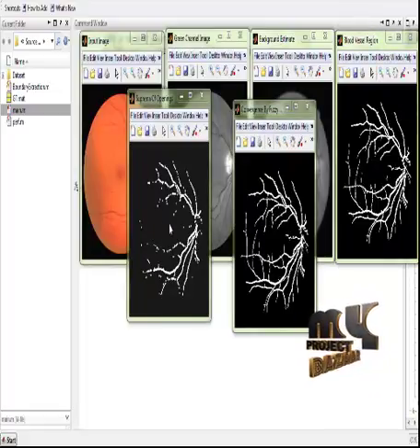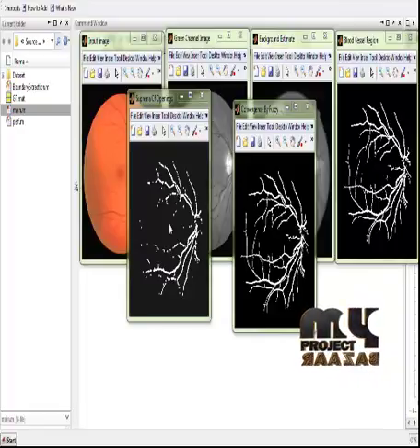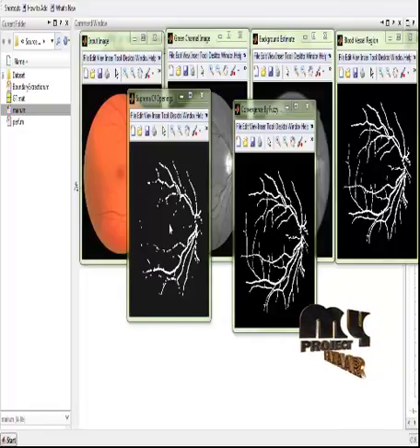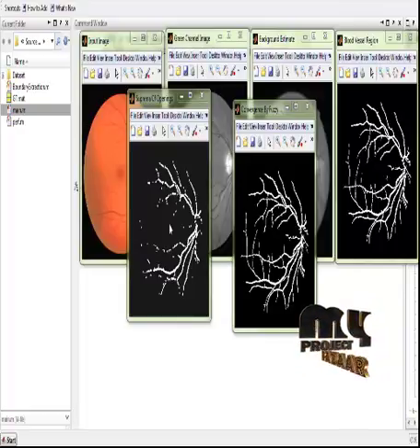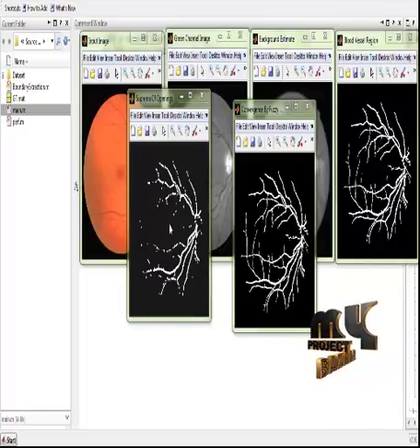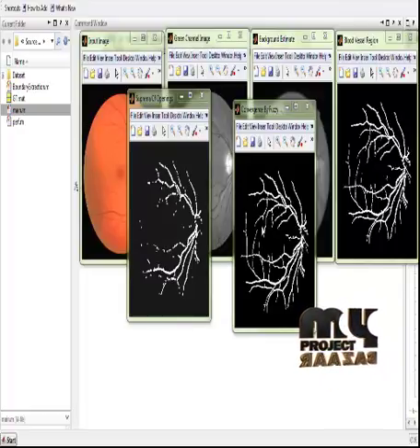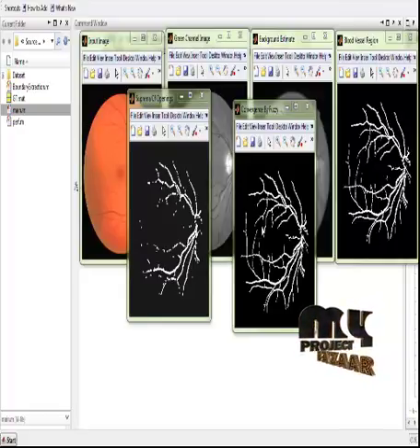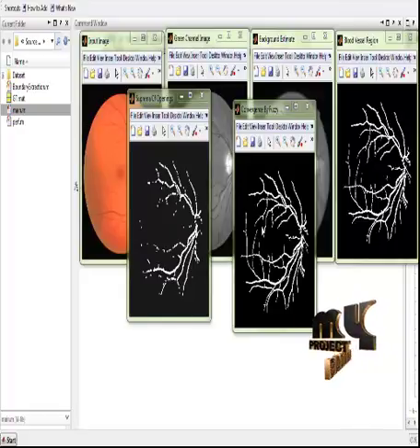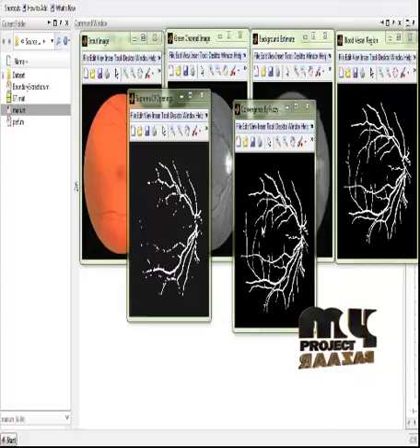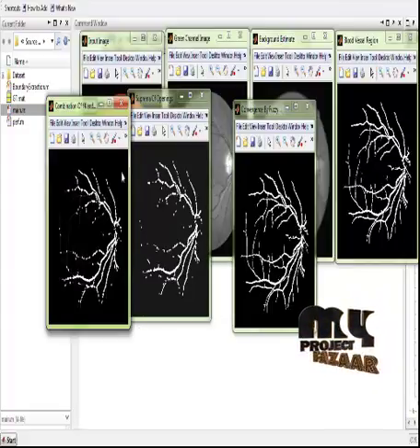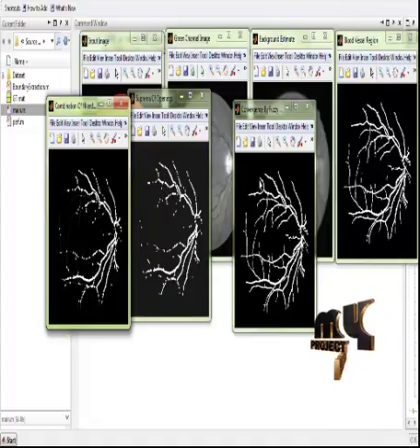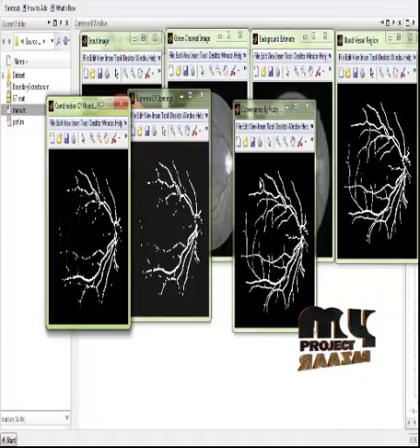From these images, we finally extract the blood vessel regions based on the morphological operation. The opening of the detected blood vessel regions detects and removes the unnecessary blood vessel regions in the input images. After that, the segmentation of the images is done based on the clustering process using the fuzzy clustering algorithm. These two images are then combined, producing the resulting combined image after the combination of the morphological function and the fuzzy segmentation process.